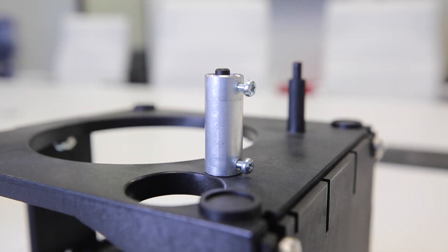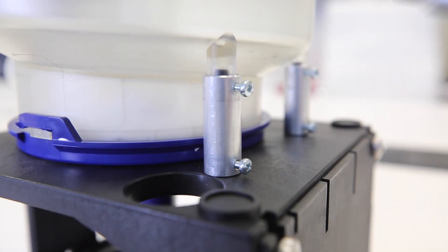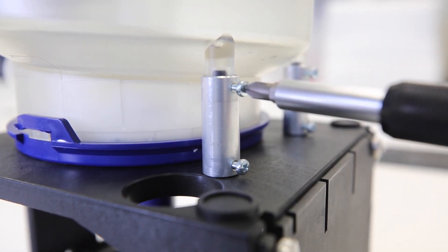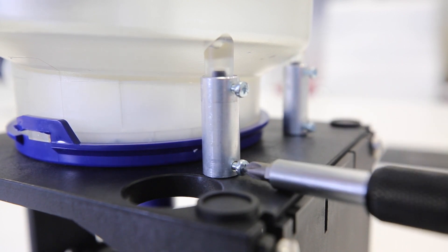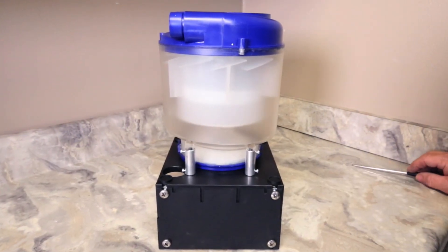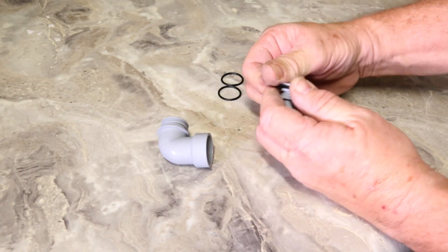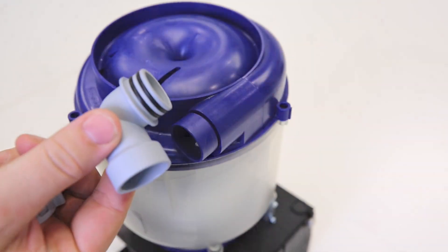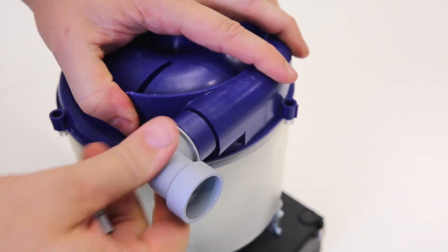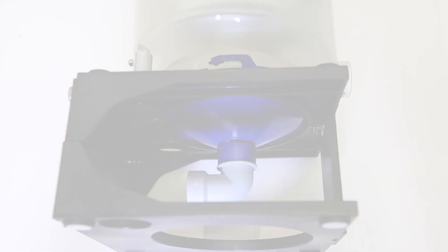Place the Eco2 unit on top of the brackets and secure using the screws provided. Find the fittings you plan to use during installation and fit the O-rings as shown here. You are now ready to start the installation.